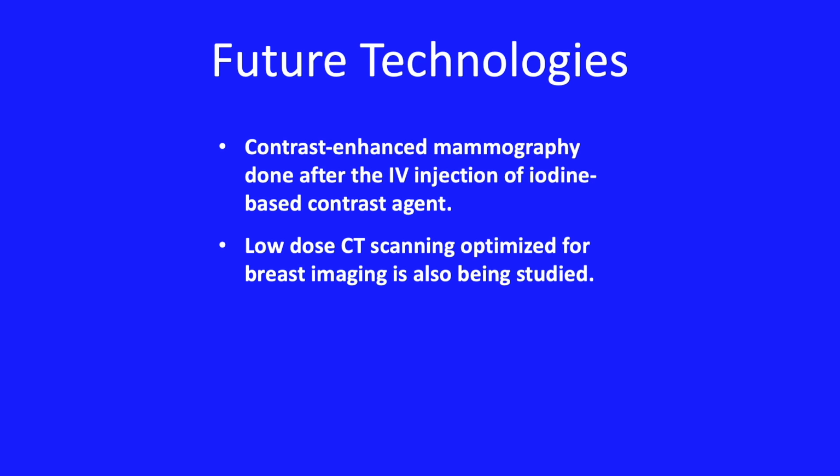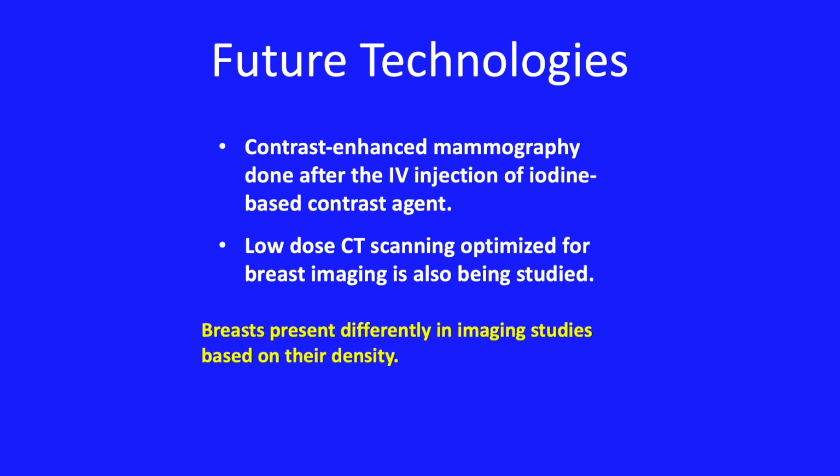Importantly, this leads me now to discuss why there remains a need to continue improving our ability in how to image the breast. And the reason is quite apparent. Breasts present differently in imaging studies based on their density.